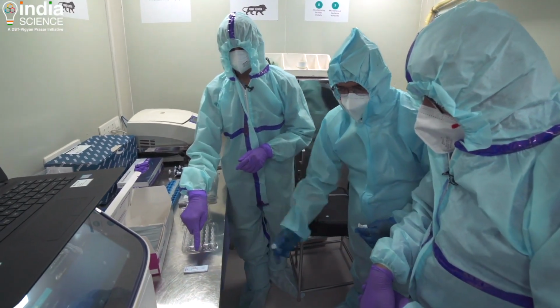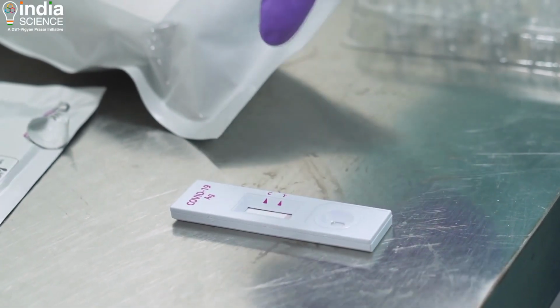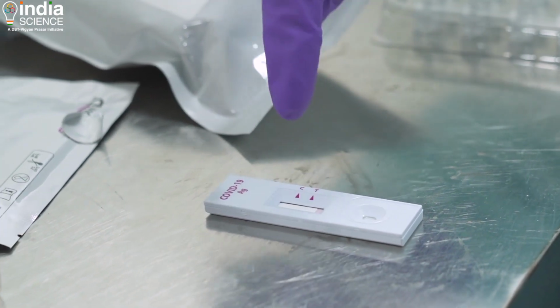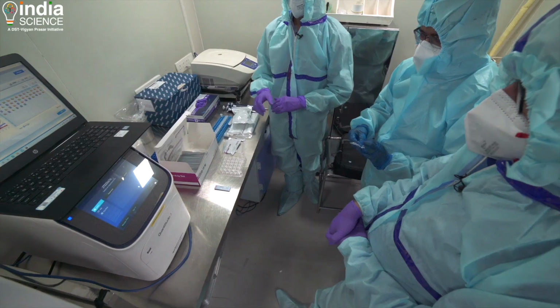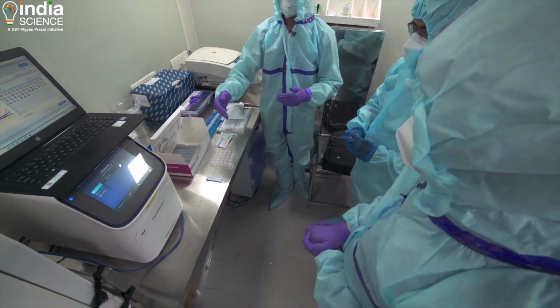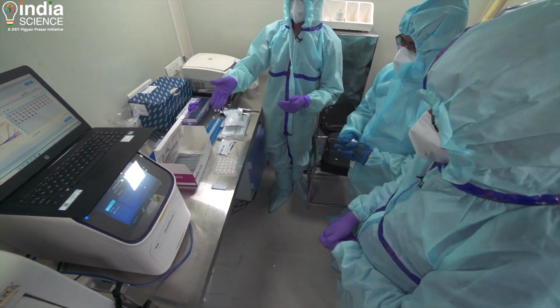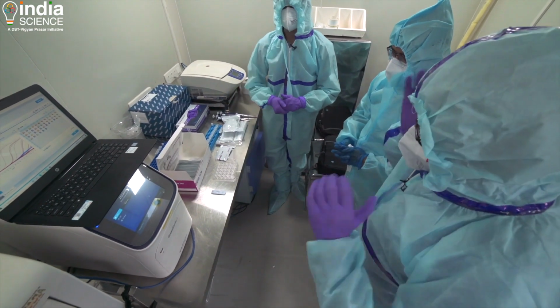Yes. So you can see the liquid is now slowly migrating on the strip. Okay, yes, I can see a slightly pinkish color which is rising. So we usually do this in batches. About 20-40 samples are done continuously. You keep adding, and then you keep monitoring the completion of the run.